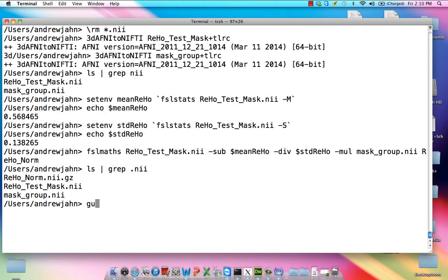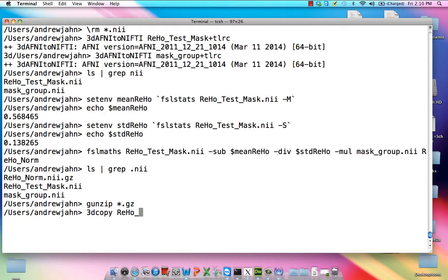And really, that's all we need. And you just can gunzip it. And if you want, put it back into AFNI format.